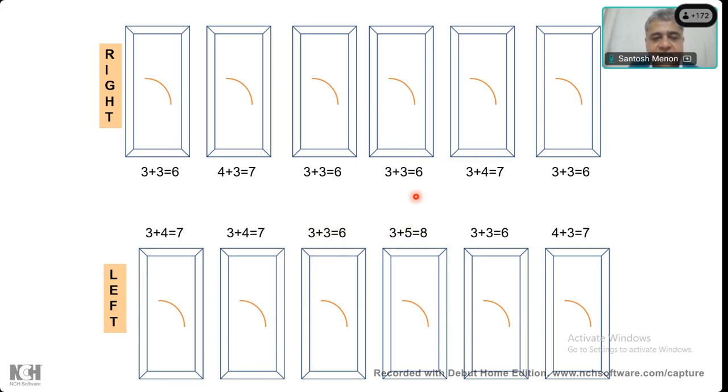We have another patient. Yes, this is another patient. Somebody needs to mute. So we have these 12 cores. All of the cores are involved. You see this? Look at this carefully. What will be your maximum Gleason score in this? 8. So when you write your report, you will score each core separately in your report. But in the bottom line, it is preferable that you mention the Gleason score 3 plus 5, 8, which is the maximum score in this. You understand?